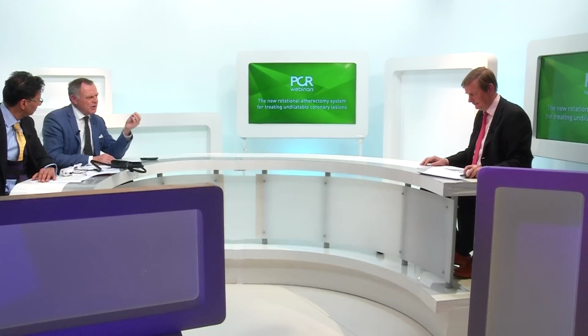Yes, I will say that it's a very fragile wire, and we have to keep an eye on this wire during all the procedure. Do not hesitate to replace the wire if it's going in a small branch. It's very important because sometimes this problem arises because we are in a small branch. Keep an eye also at the exit of the guiding catheter because sometimes you may have a loop, and because it's a very thin wire, you cannot see the loop, and if you have the loop, you may have some problem. And if you see that the wire is kinked, do not hesitate. Change it and take a new one.